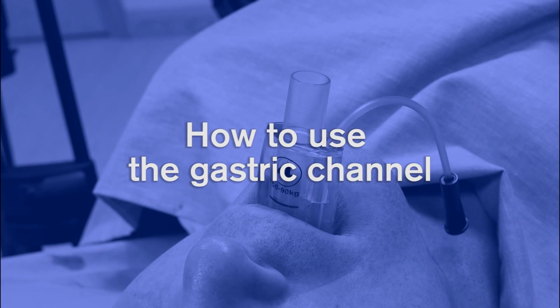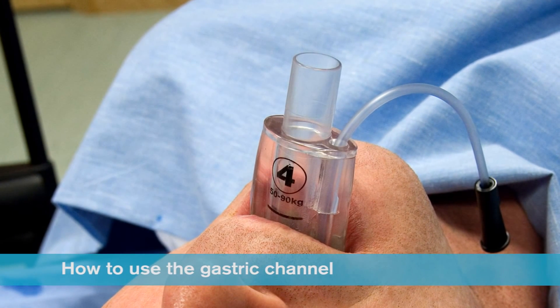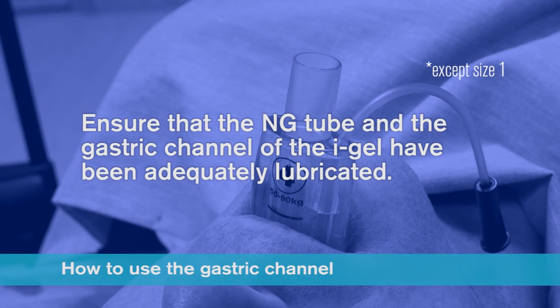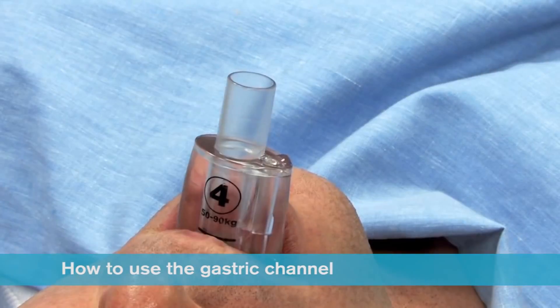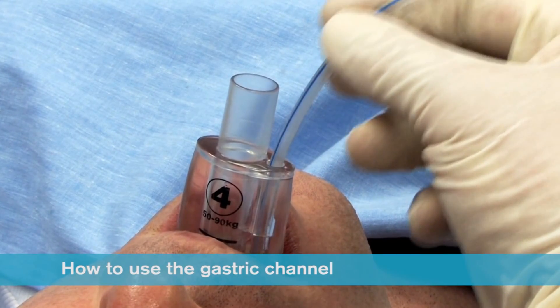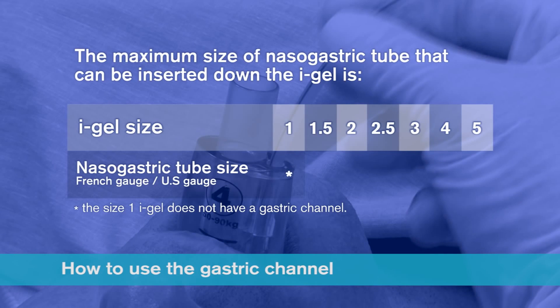If required, a nasogastric tube can be inserted down the gastric channel of the iGel. For a quick and efficient insertion, it is important that the nasogastric tube and the gastric channel of the iGel have been adequately lubricated before insertion is attempted. Place a small bolus of lubricant over the proximal end of the gastric channel, then insert the nasogastric tube a short way down the channel and move it in and out to prime it before completing insertion. The maximum size of nasogastric tube that can be inserted is size 10 French gauge for a size 1.5 iGel, 12 French gauge for a size 2, 2.5, 3 and 4, and size 14 French gauge for a size 5 iGel.